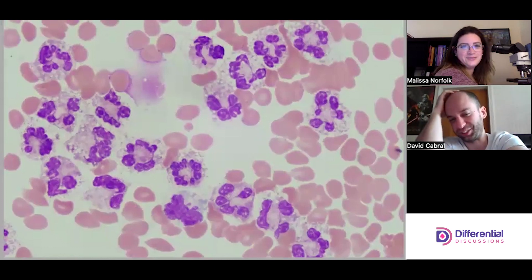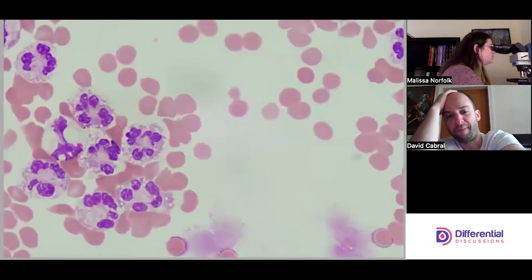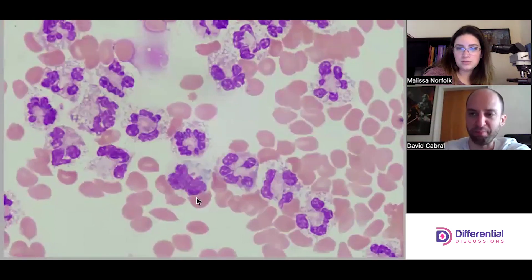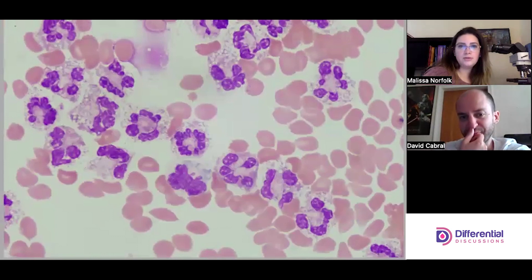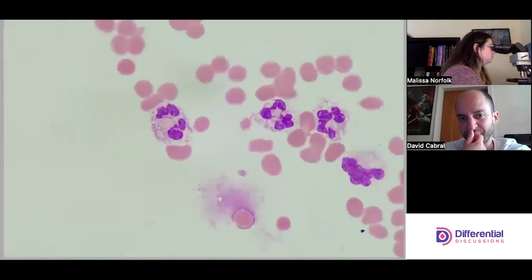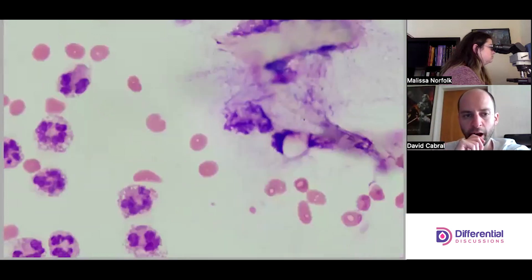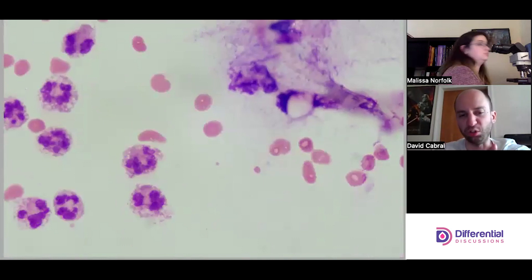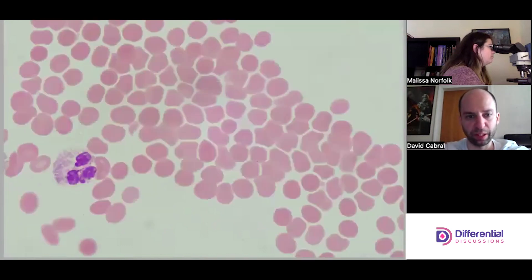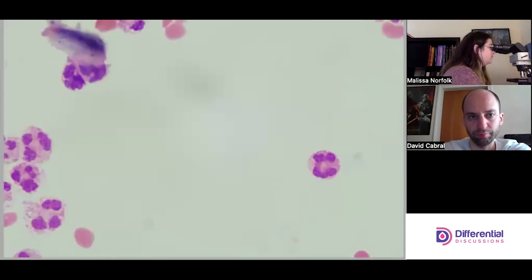Really just lots of neutrophils here, and perhaps the occasional monocyte or macrophage. There are quite a bit of vacuoles but they're all nicely round. I don't see any organisms — no bacteria or yeast.